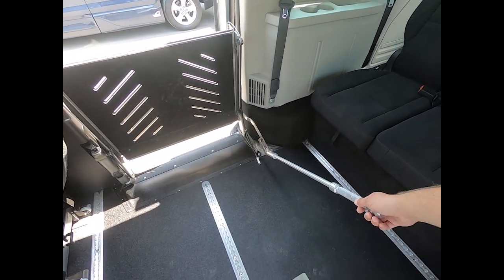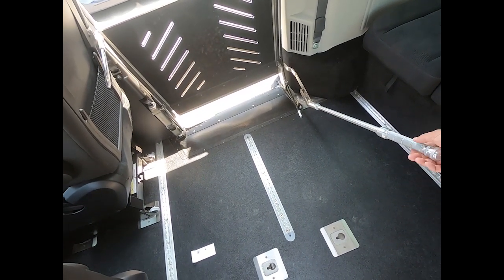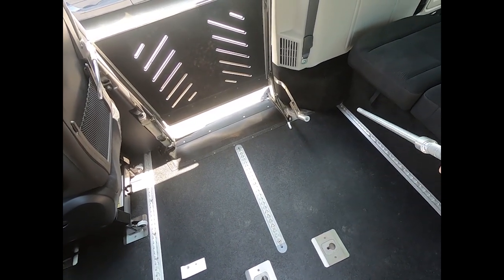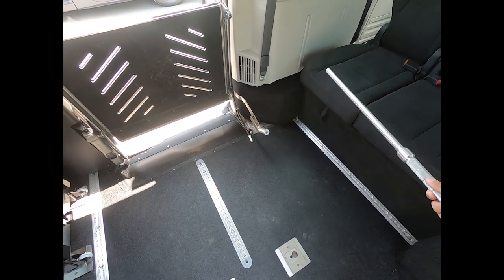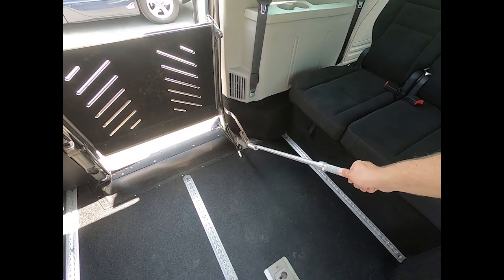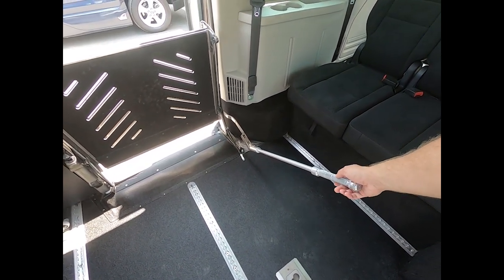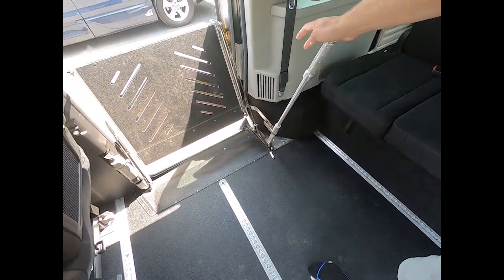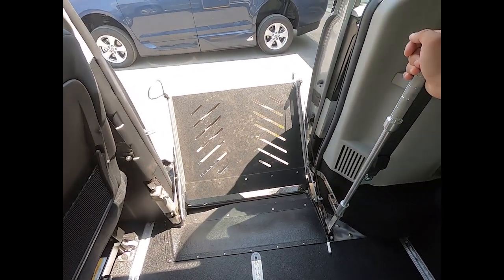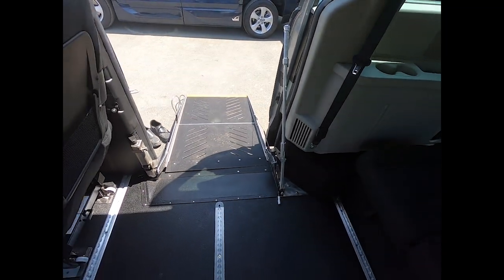You might say, what about the bar — isn't that in the way? His wheelchair is going to be in this space and he's not going to be able to turn around. That's true, which is why it's removable. You just take it out and put it wherever you like. When you get to where you're going, put the bar back in, grab the handle, give it a pull, and the whole thing comes out of place and right down. You're on your way.